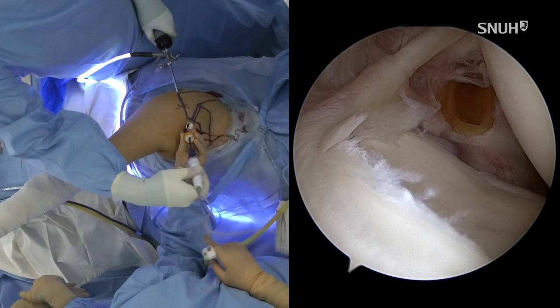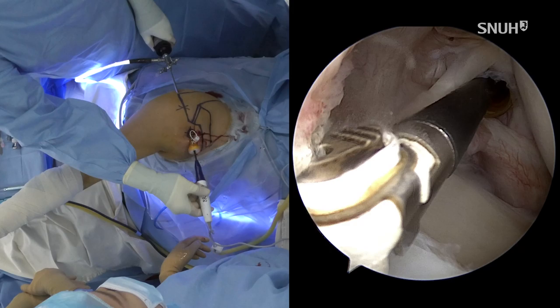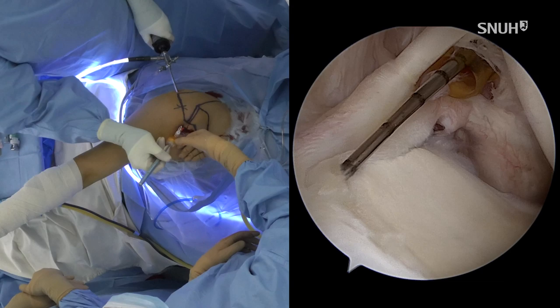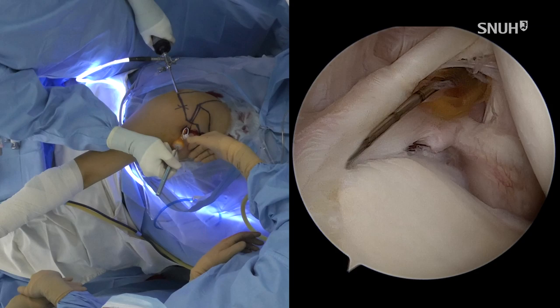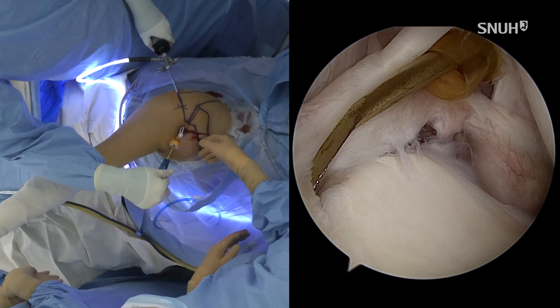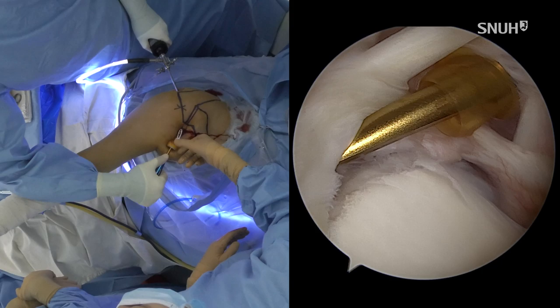And here, we can see the posterior extended SLAP, a little bit until 10 o'clock. So I will decompress the cyst through the SLAP lesion. I will try to decompress this cyst through the anterior cannula using sharp elevators. Here you can see the ganglion cyst is coming out.